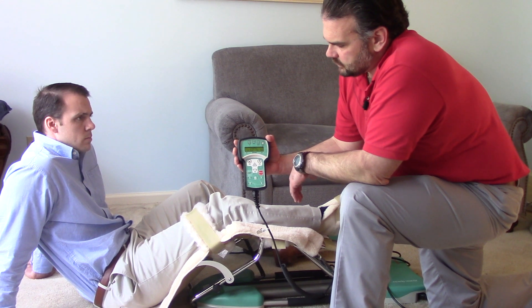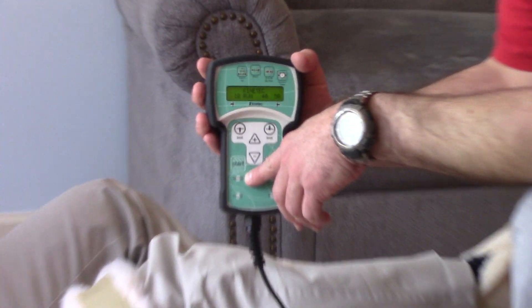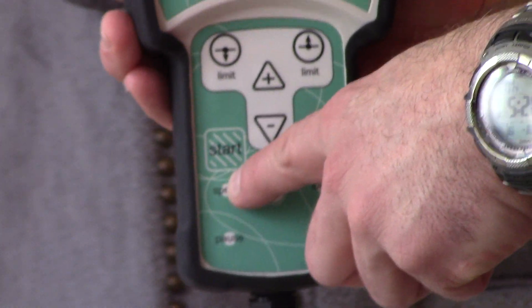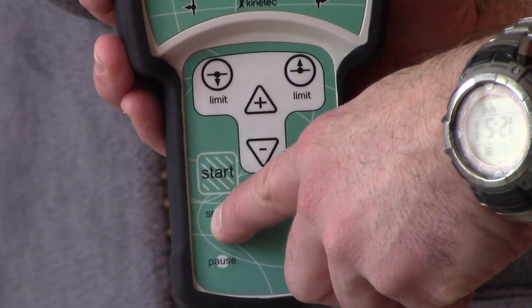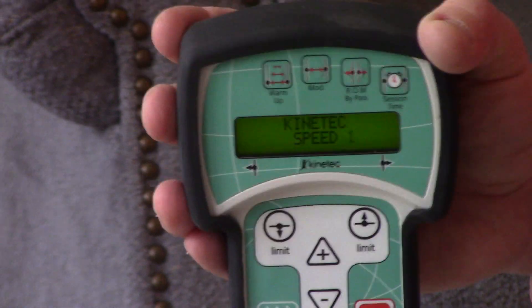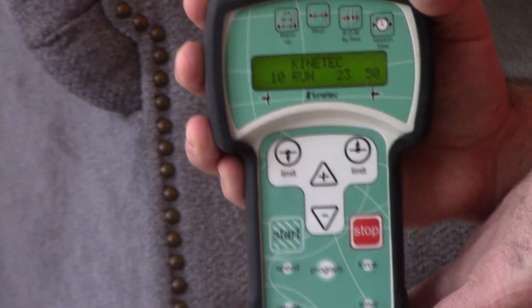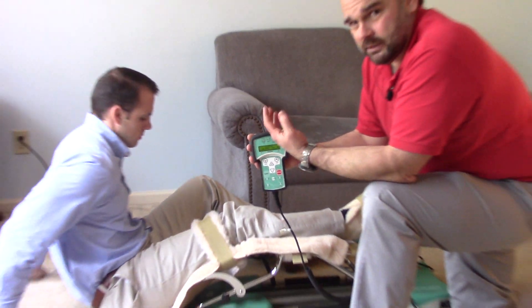The other thing I'd like to show you is the speed button. You can set the speed — it's set from 1 through 5. We tap this speed button just below the start button. Right now it's on 4. On the day of surgery, you're going to start at 1, which is super slow. We're not trying to cause pain; we're just trying to have you move your leg and get some blood flow into the area.